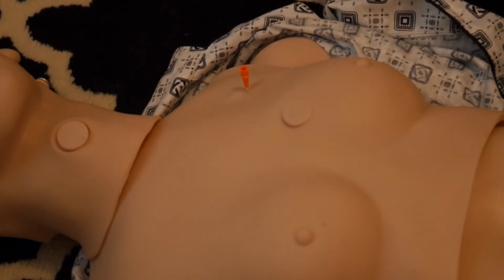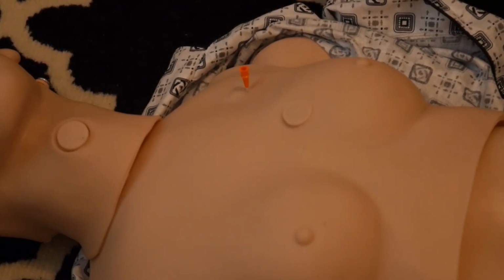So there are a couple of risks. You might puncture the heart. You might also puncture an artery and cause a hemothorax. You might puncture veins or nerves and cause nerve damage. And for the other two sites, the steps are basically the same.